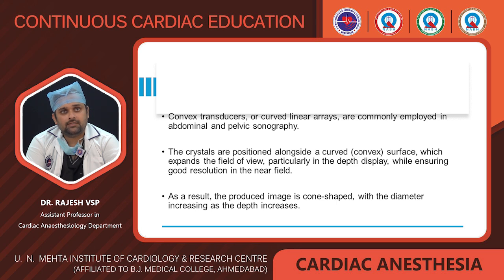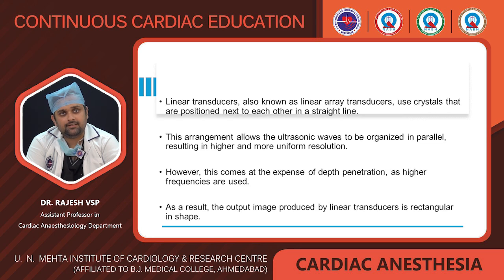Coming to convex transducers or curved linear arrays, these are commonly used in abdomen and pelvic sonography. These crystals are positioned alongside a curved surface which expands the field of view, particularly in depth display, while ensuring good resolution in the near field. As a result, the produced image is cone shaped with the diameter increasing as the depth increases.